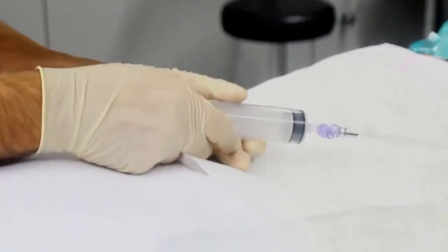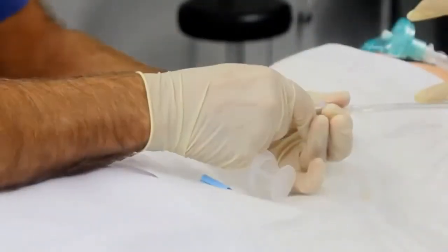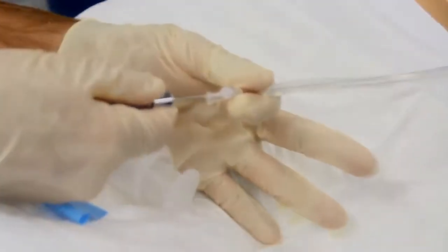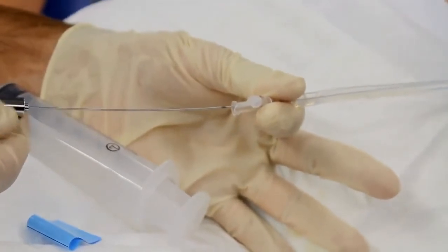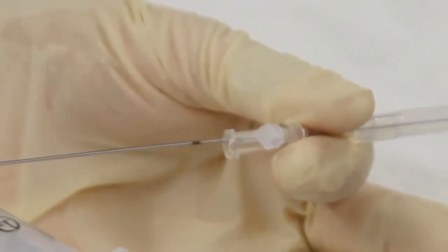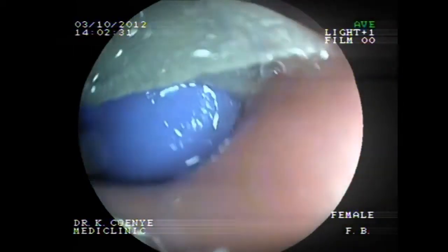Releasing the balloon. Once the balloon is filled, unscrew the stainless cannula of the anti-return valve. With one hand, slowly pull the cannula, while with the other hand, maintain the catheter at the exit area of the teeth holder. Retract the inflating cannula inside the catheter, corresponding to the black mark of the cannula. Then, slowly pull on the filling catheter. This will allow the release of the balloon at the cardia level.